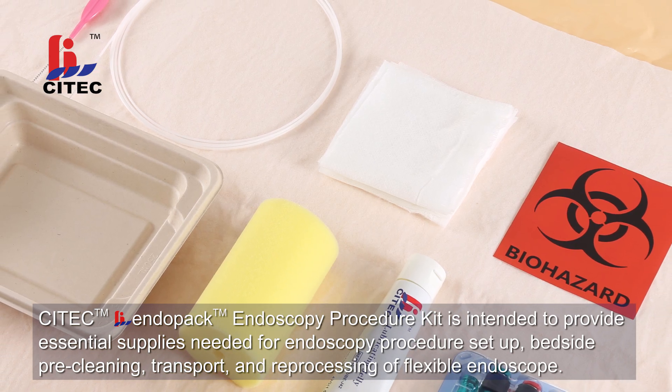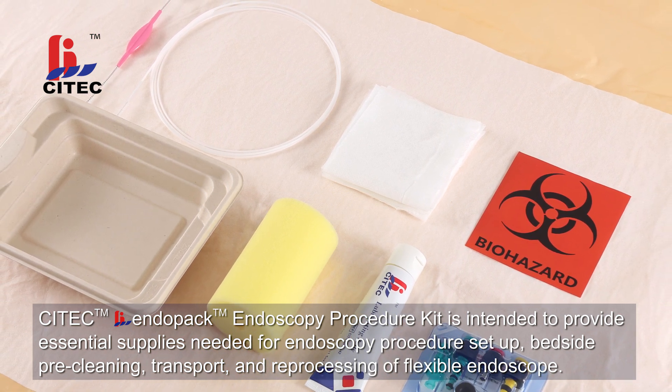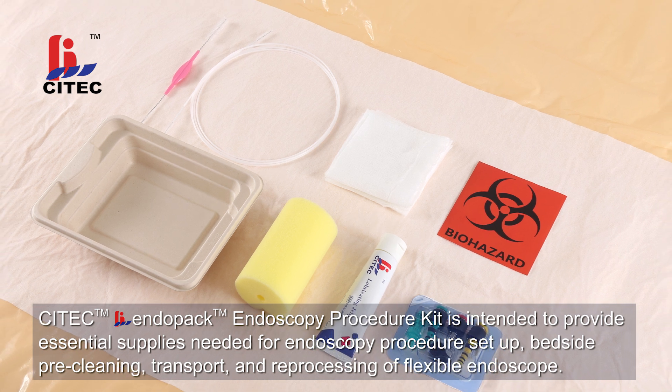Scitec Endopack Endoscopy Procedure Kit is intended to provide essential supplies needed for endoscopy procedure setup, bedside, pre-cleaning, transport and reprocessing a flexible endoscope.